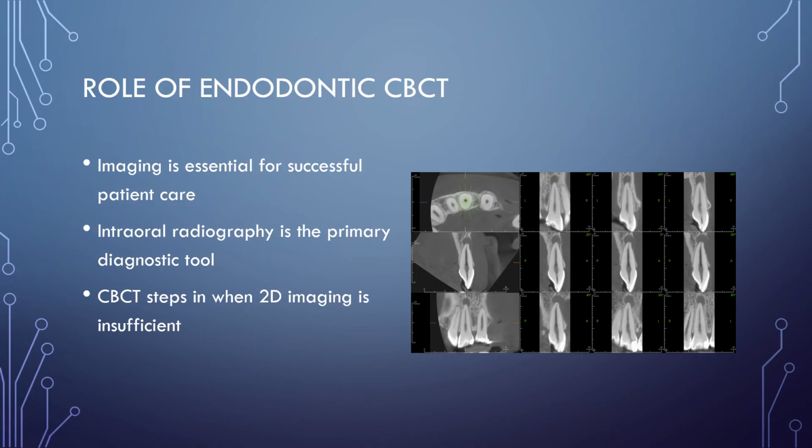Radiographic imaging is the absolute cornerstone of endodontic therapy because it provides essential information that is unobtainable through clinical examination alone. In daily practice, intraoral radiography serves as our foundational diagnostic tool and is officially considered by the AAE as the modality of choice for initial evaluation.